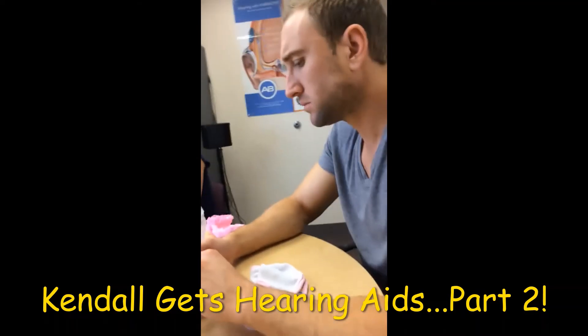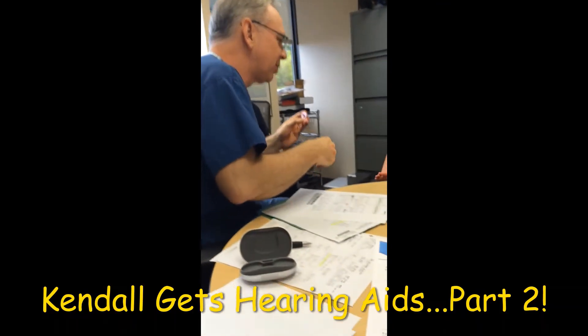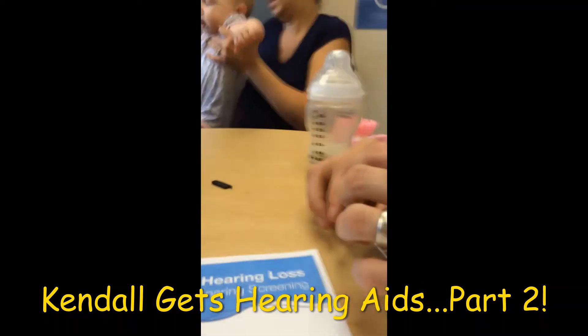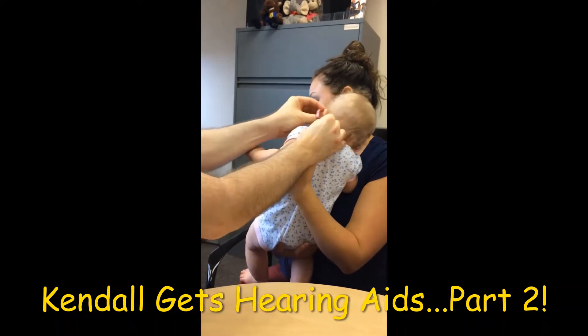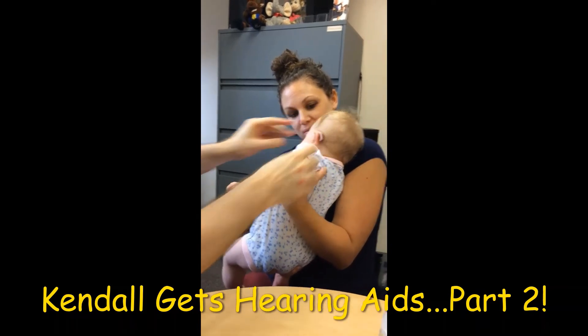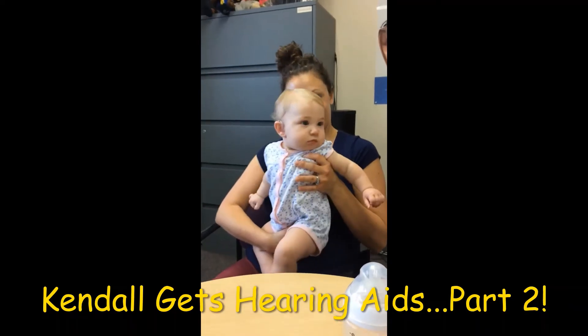Everything else — I'll give you your homework. Why don't you pivot her bottom so I can get her left ear a little bit more easily. I'm just going to run at her so dad, you can watch very quickly. So down — see, I got it in the ear. Count dad, you see that? I hold her ear just a little bit, twist back and mash it up in there and toss it over the ear. Mash, mash, mash. And there you go.